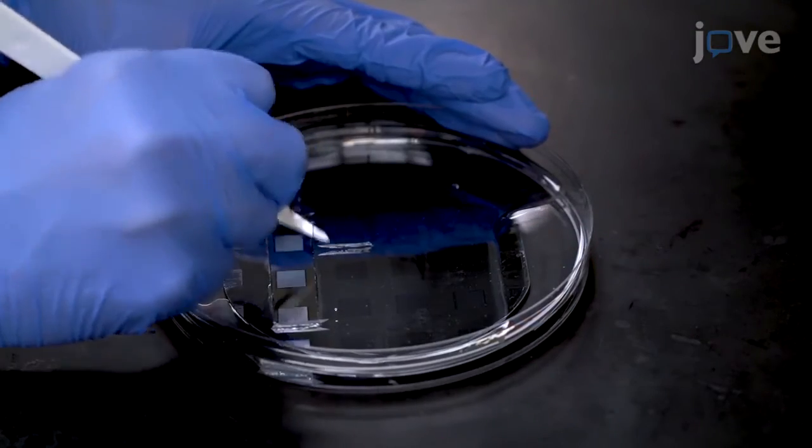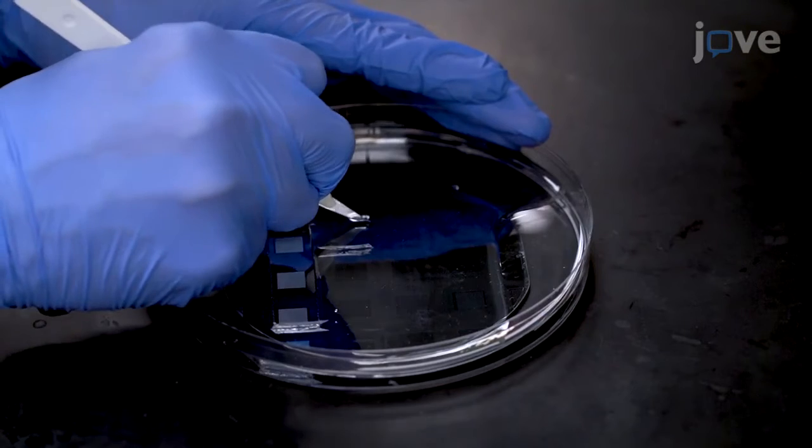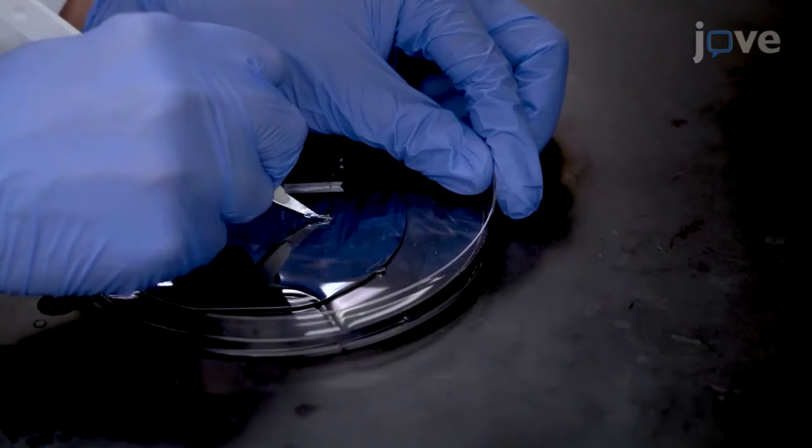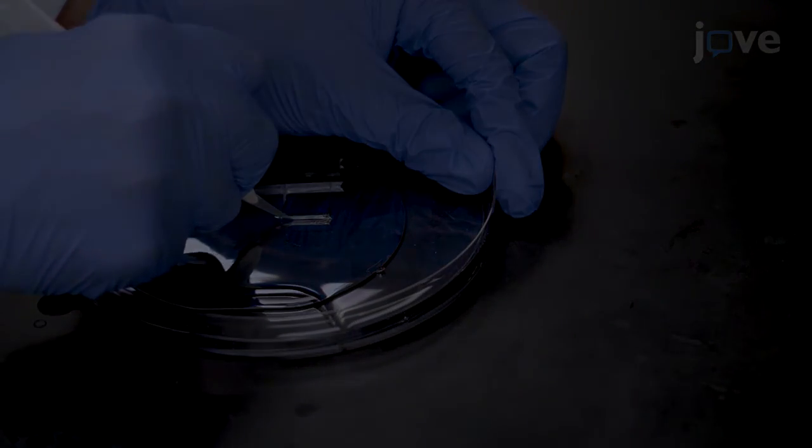Allow the PDMS to cool to room temperature, then use a surgical scalpel to cut stamps of 30 by 30 mm squares containing the correct patterns, taking care to not damage the silicon.